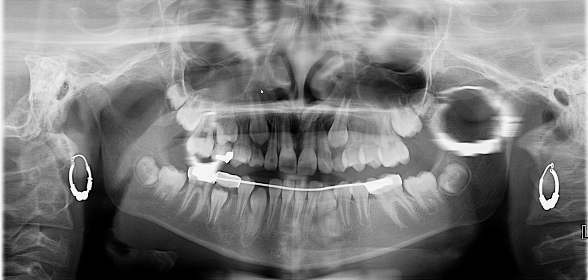The first thing you have to do is visualize what permanent teeth are present and also the primary teeth that have not yet exfoliated. You have to determine that first. This also requires your overall understanding of the eruption pathway of the permanent dentition.